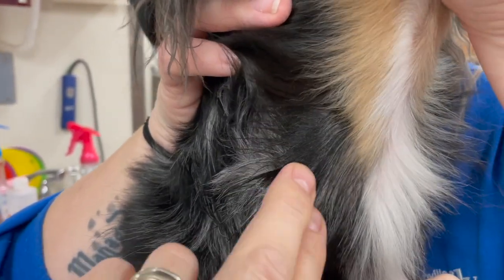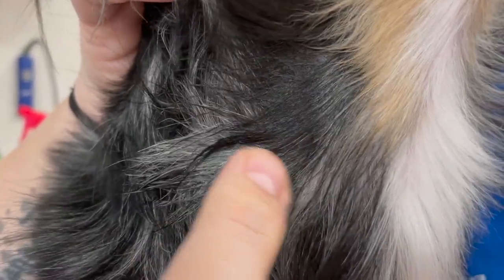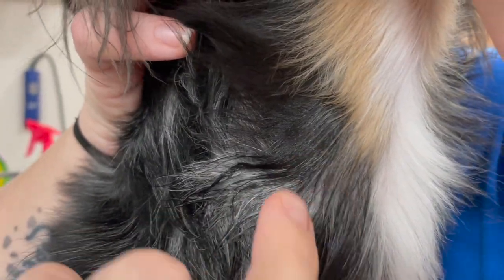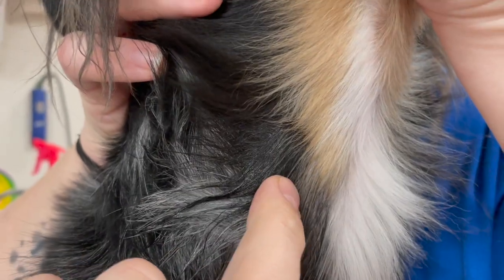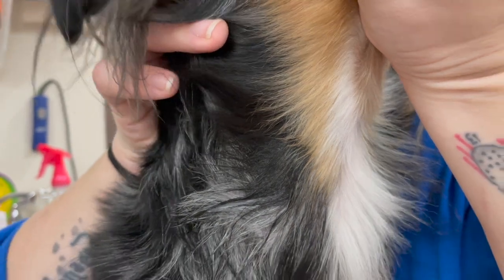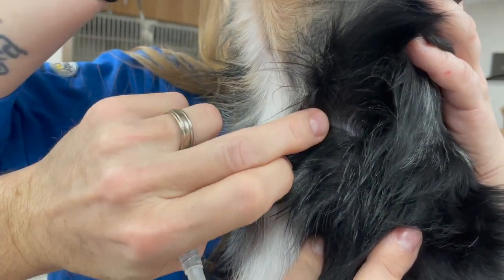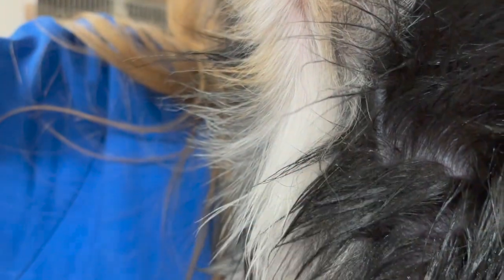Look, if I move it, maybe you can see it right there. Can you see it on film a little bit? It shines off of there and when you bounce it you can see the vein under there — you can visualize the thickness of it, you can feel it. I don't know if you can see it but I can feel it's right here. It's like a rope — feel that rope under there.